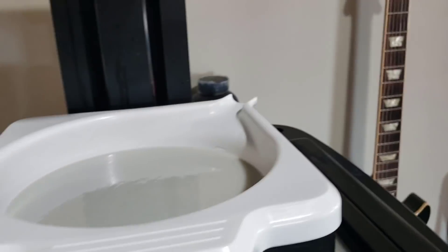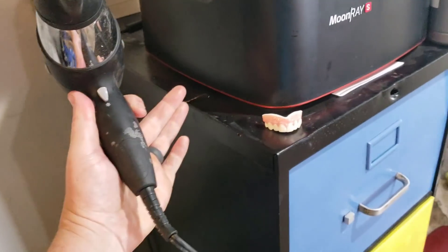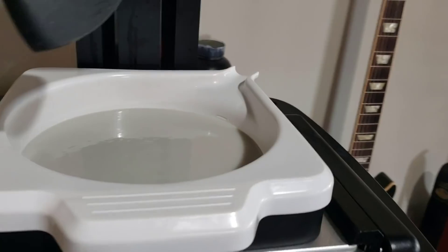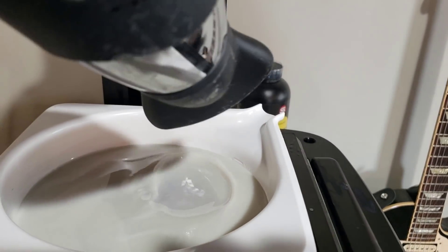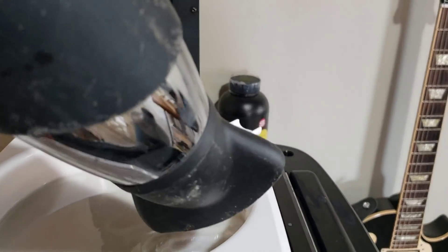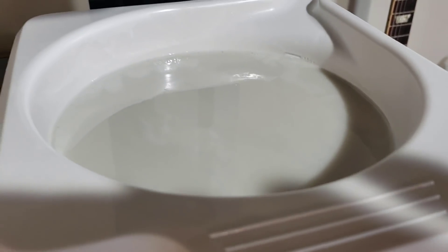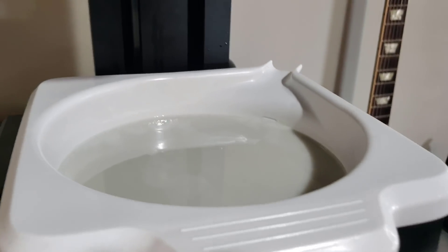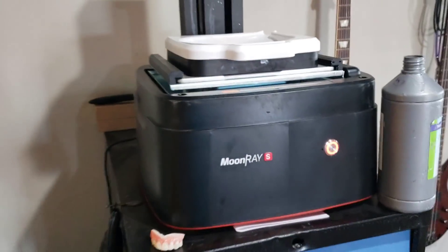If you want to get rid of even those bubbles, you can also keep a hairdryer mounted to the side. Just kick it on, and very quickly, whatever bubbles may have been in there — just the heat from that hairdryer causes the bubbles to expand and pop. So now you don't have to worry about bubbles causing a failed print.